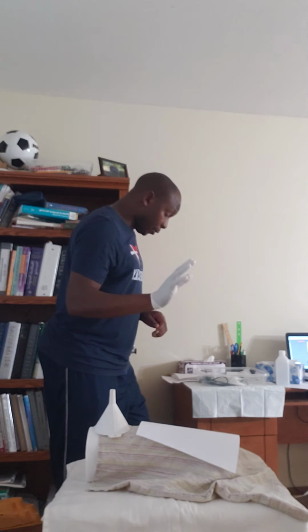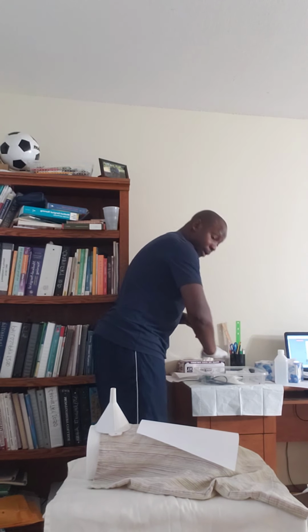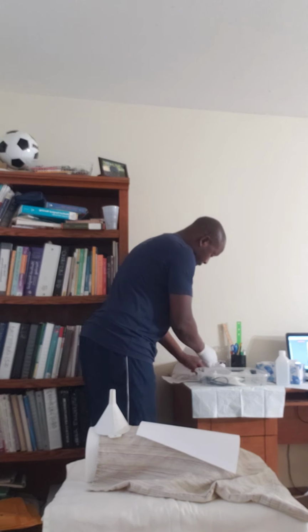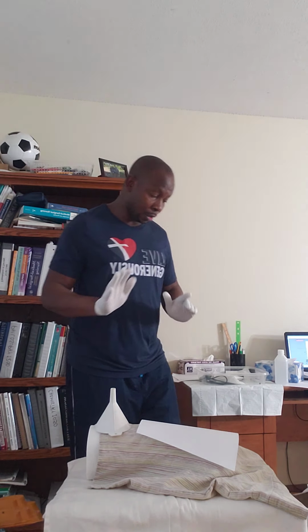If it is at 6 or 12, it has to go this way. So now I'm going to follow the way it is. Then I'll place the cannula in the normal saline again. That one is the normal saline. I'll be pressing over there, and then I'll put on another glove. This glove is sterile. So now I'm sterile.